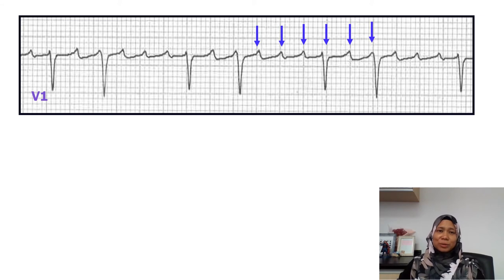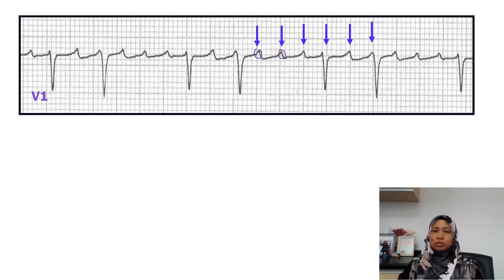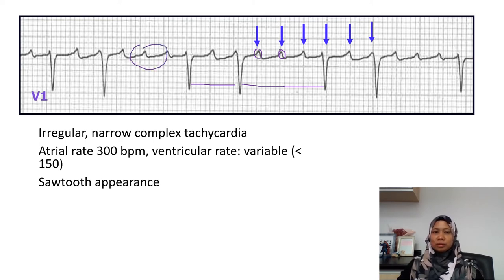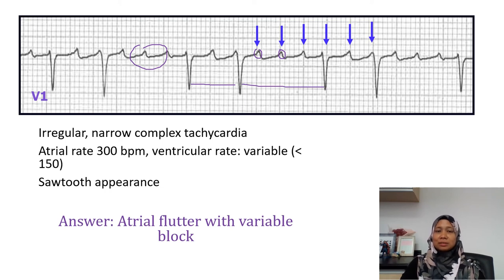The next strip shows an irregular rhythm because the RR intervals are not the same. The atrial rate from here to here is about 300 beats per minute, while the ventricular rate is less than 150 beats per minute. It is an irregular narrow complex tachycardia, and if you remember there is a sawtooth appearance here — so this is actually an atrial flutter, however it is irregular because there is variable block at the AV node. So this is atrial flutter with variable block.